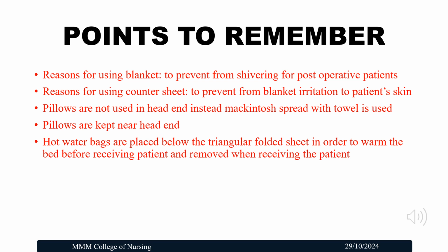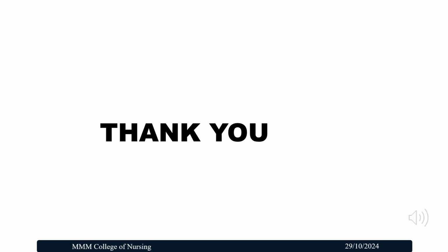Hot water bags are placed below the triangular folded sheet in order to warm the bed before receiving the patient. As soon as we receive the patient, we must remove the hot water bag.